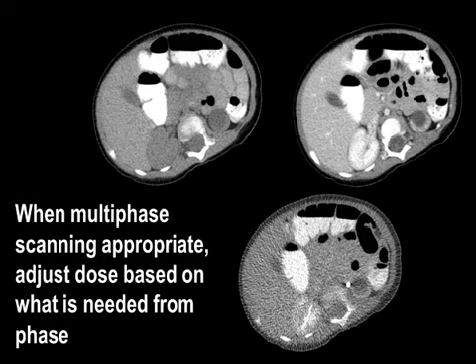This was a child that has a cyst on the lower part of the left kidney right here. And we saw that with ultrasound and was going to the operating room because it could have been a tumor. The surgeon, the urologist, wanted more information on the extent and nature of this. So we needed to get pre-contrast studies because we wanted to measure any change in the Hounsfield units to see if that cyst enhanced, which it didn't. We wanted to be sure that that wasn't part of the collecting system, and it wasn't because contrast on delayed images didn't go in here. But you can see this is a very noisy exam, but all we needed to see was whether contrast went in here.